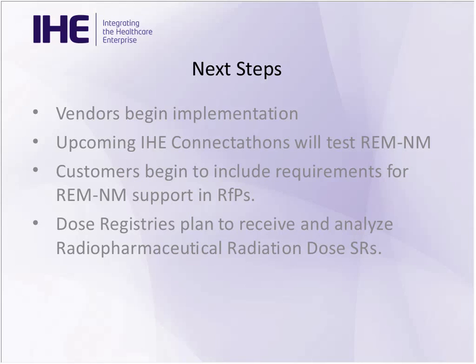And as Jeff mentioned at the beginning, ASNC has a registry. Dose is a part of the registry, and activity is part of the registry. They've shown interest in the RRD, the REM, NM. And I know that the Society of Nuclear Medicine is interested in building out registries, and what is administered to the patient is a key component to anything in nuclear medicine and PET. So I think this will be well served for them.